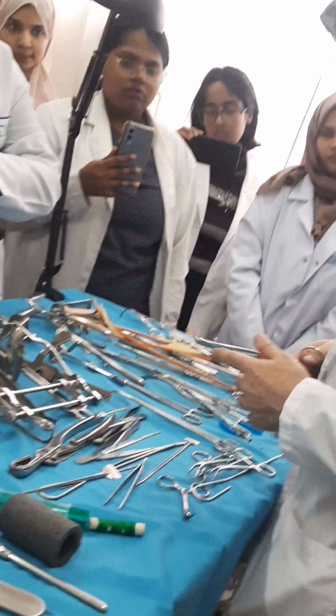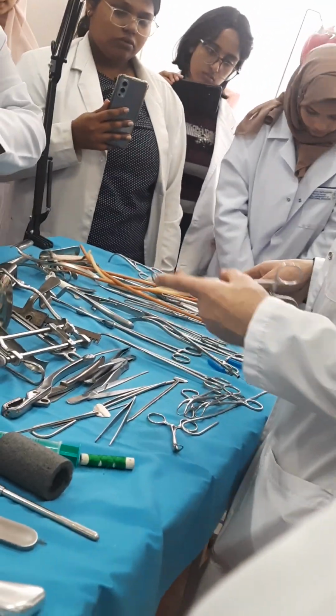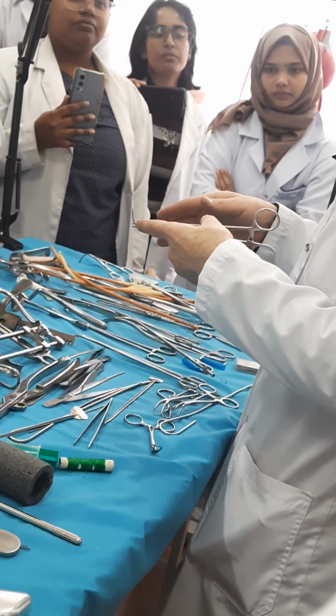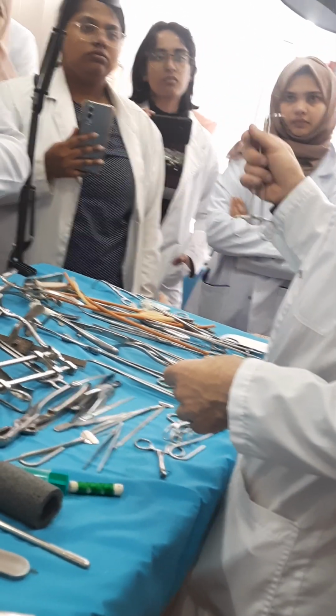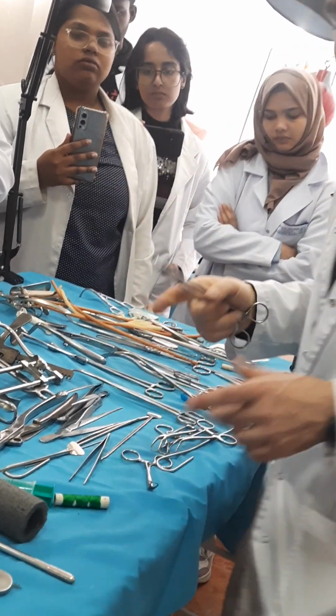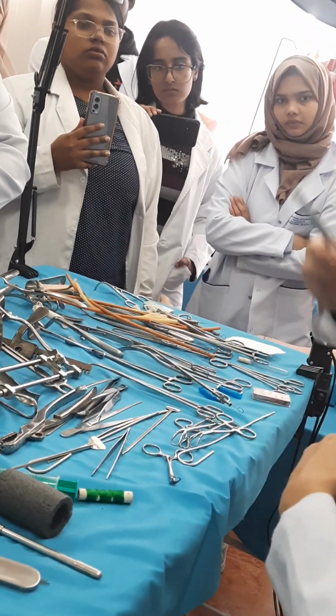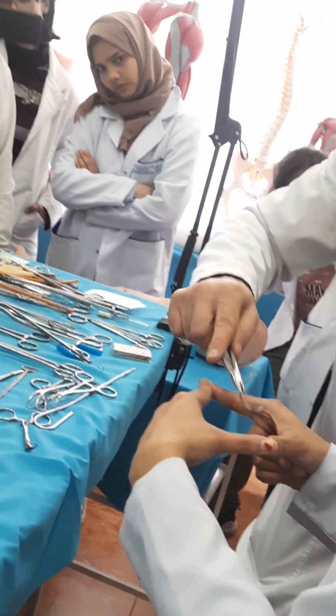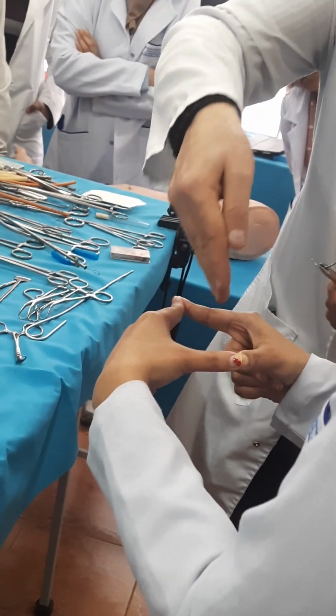Classification number 2. All needles, doesn't matter if traumatical or atraumatical, can be straight or curved. 99% of needles in surgery are curved needles. Why? Because, hold your fingers like this. I must take deep structures in the suture. If I have a straight needle, it means I will insert it into my hand.